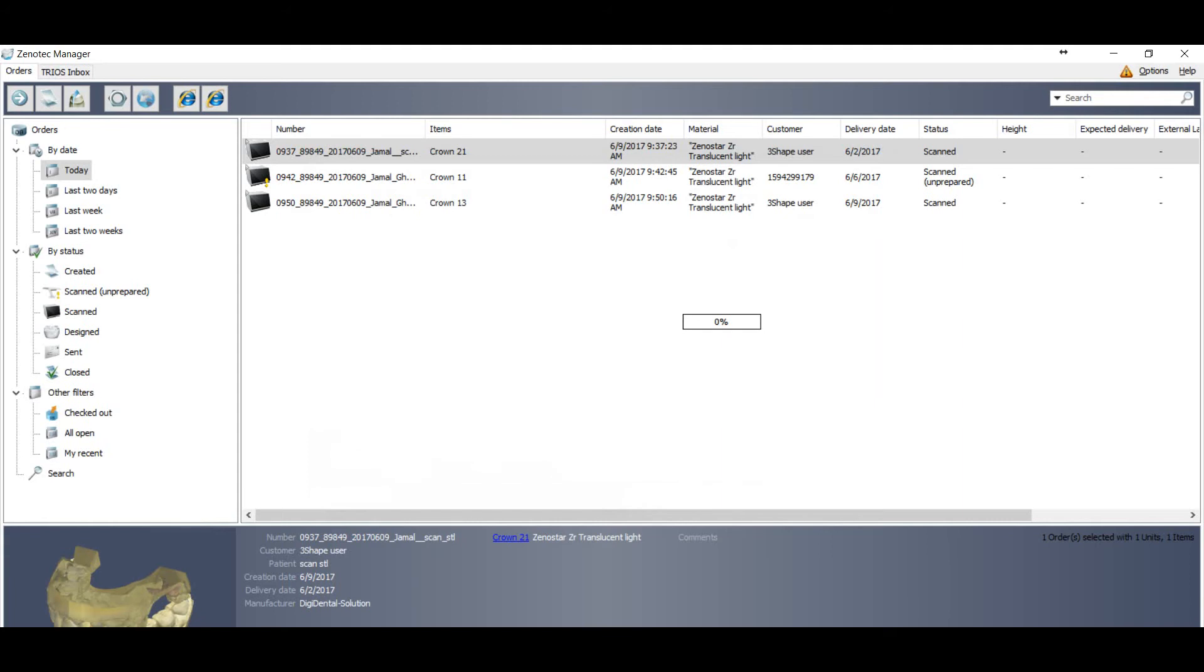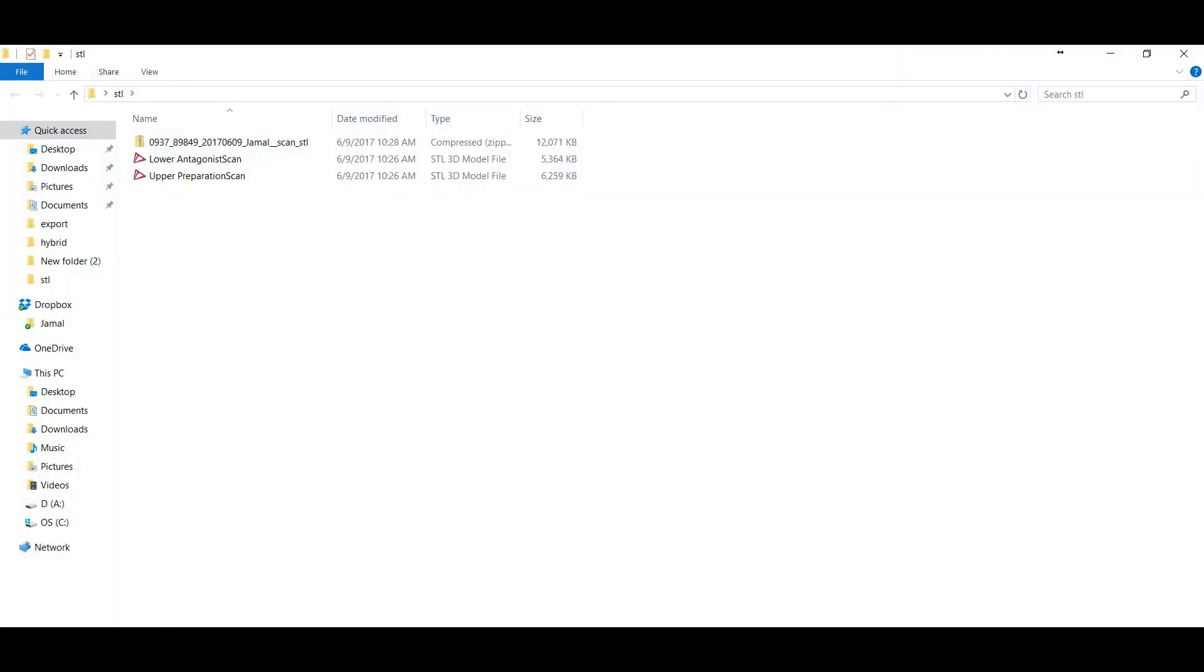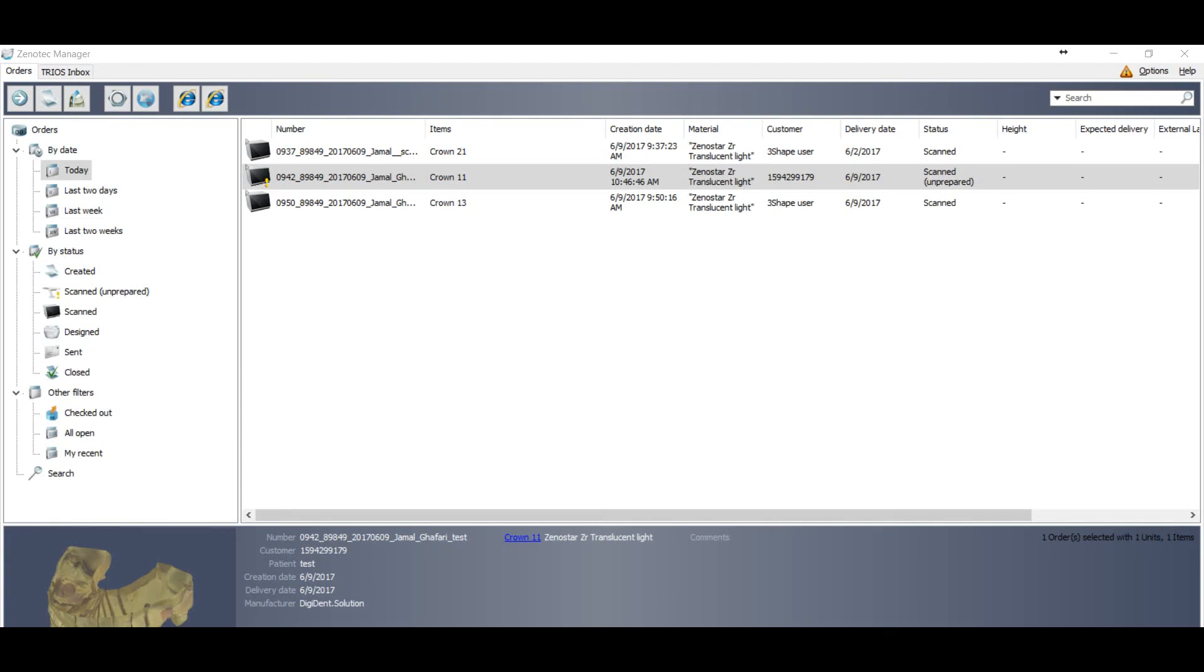Now you can save your folder where you want to save. Save it.